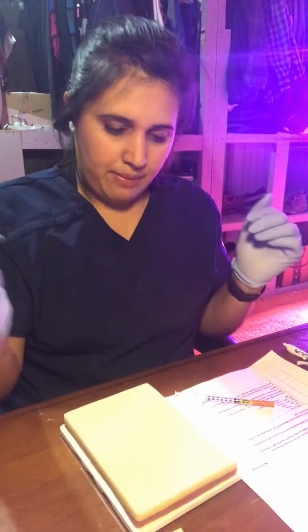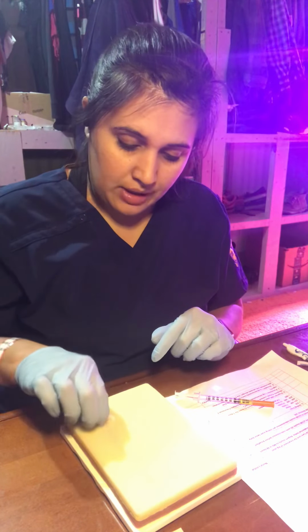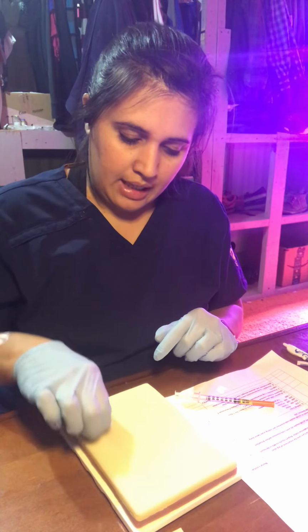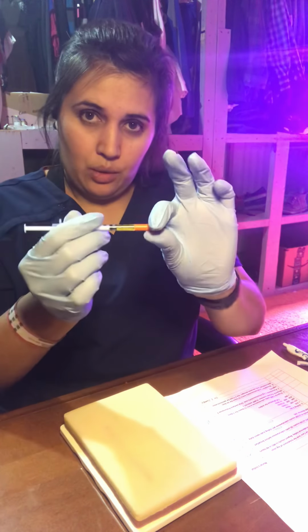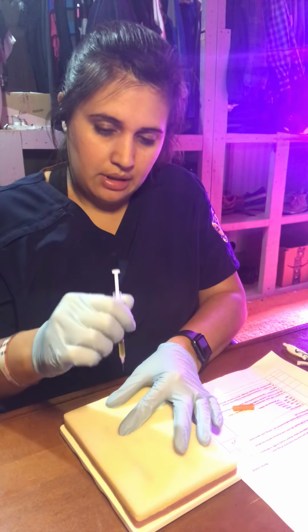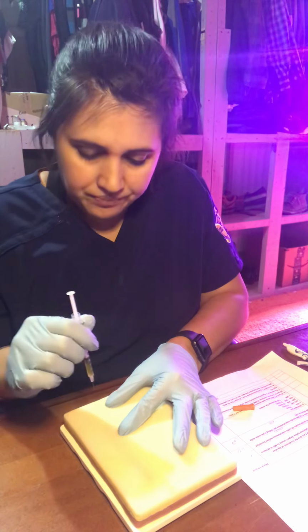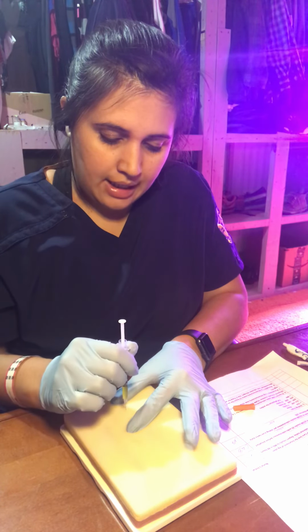Okay, I'll take my alcohol swab, and on the site in the back, or on the belly, I am going to administer and clean in a big circle. I am going to remove the cap, hold the skin out taut a little bit, and go 90 degrees and in.